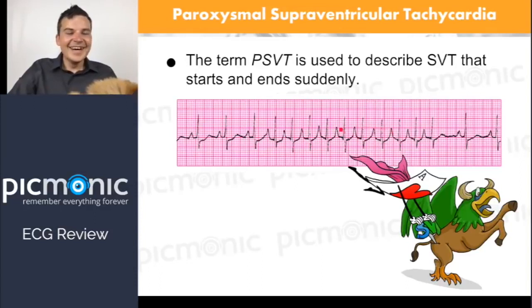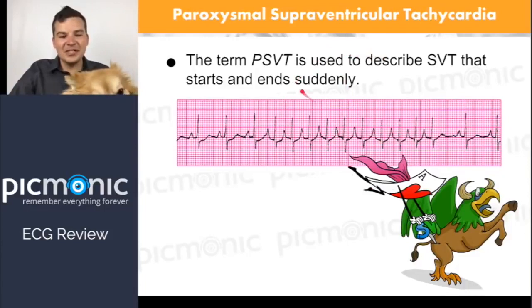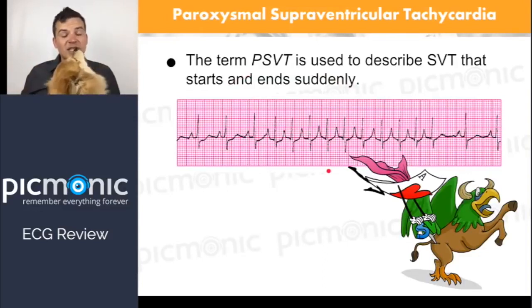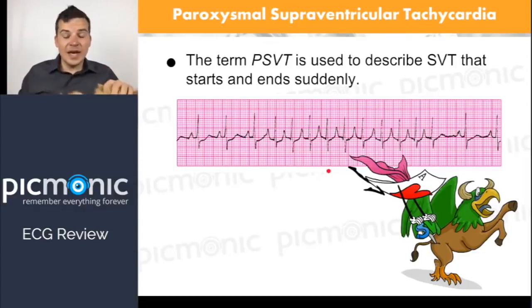Sorry. Oh, okay. So as we look here, this is why we call it paroxysmal. It's normal, it comes, and then it goes away. So before I talk about that, somebody already mentioned it once, but when we talk about SVT, it's really important to know that paroxysmal SVT, anything that's randomly coming and going, is usually a sign for something that's going to come and stay and be very problematic. This is the same when you think about TIAs, transient ischemic attacks. They come and they go, and you're all fine until you get the big one, right? And then it doesn't go away.